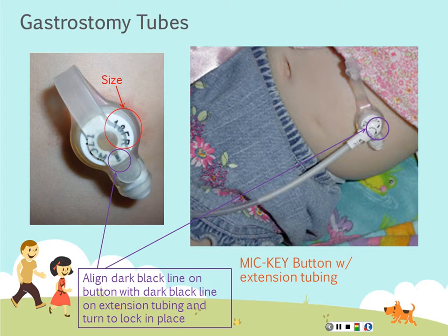The biggest thing when you're looking at this is you're looking at their stoma site overall. The skin should look normal around it. The stoma site itself should be pink. You should be able to move the button. It should not be stuck to the patient's skin. You're not going to sit there and twirl and whirl it in a circle, but you should be able to move it. If there is secretions present or drainage, you want to note what it looks like.